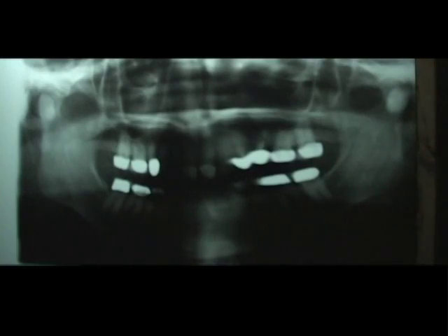This is this patient's Panorex X-ray, and I show it to you to show that frequently most dentists do not look in the TM joint area. But if you look closely, you can see that she has very narrow, if any, superior joint space on both sides of the film.